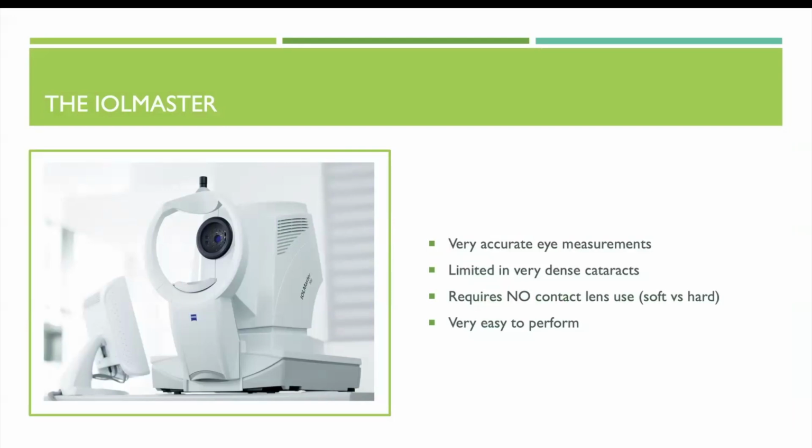So with the IOLMaster, you've either got the 500 or the 700, but essentially it's a very, very accurate machine, and it's replaced what we used to use, things like the A scan, for example. The only limitation with the IOLMaster is that it's quite limited in very dense cataracts, but with the 700, for example, you're usually able to get a reading in around 99% of patients. So it really is the very, very dense cataracts that you're not going to be able to get an IOLMaster reading from. And it doesn't require any contact lens. There's no contact on the eye.